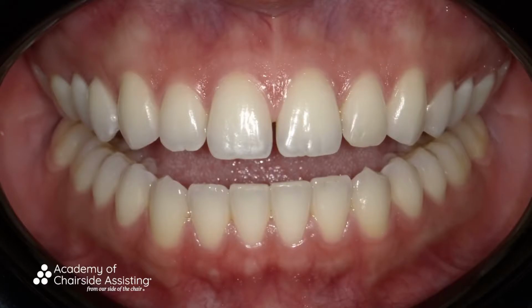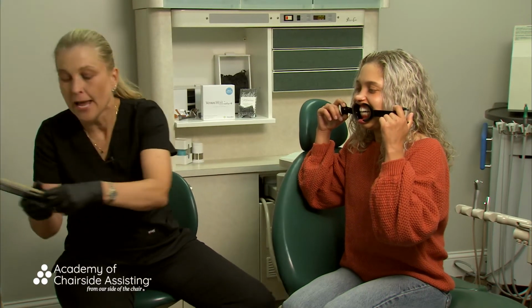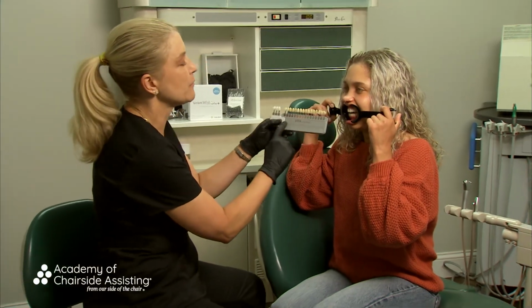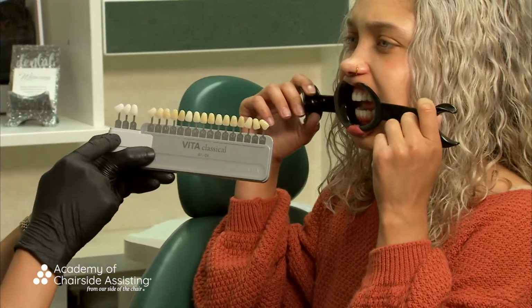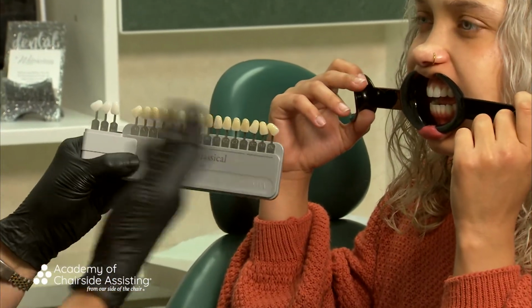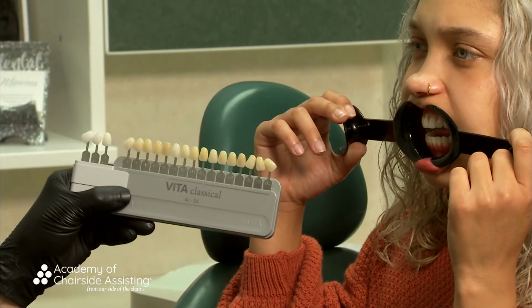Great. And stay just like that for me. I'm just going to put in my shade tab. Let's just see where you are. I'm using our Vita classical guide. Now, I will say that a lot of team members will use this guide and they don't have these bleach shades on the end. This is very vital because I know Haley is going to get amazing results because she has done this before and really got great results. So I definitely know it's going to happen again.